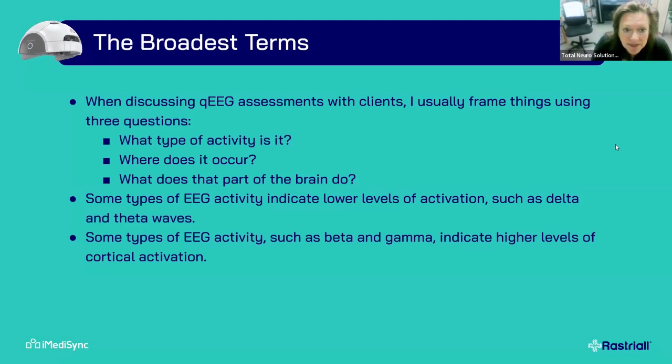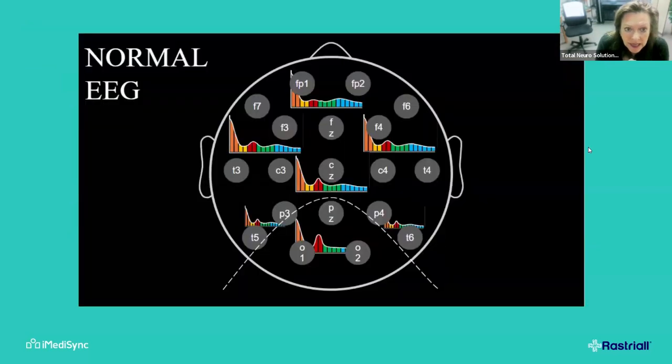So that's the story that the EEG is able to tell us. And we can look at overall activity, processing speed, which is kind of your sampling rate of the world. Different waves give us different types of processing. I'll go over this more in our second webinar, but we know that slow waves should be in certain places, obviously bigger during sleep, and stay in the back of the head during processing and task-oriented activities. You can go to the next slide.